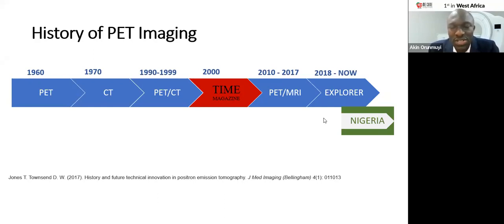And the development in PET-CT technology has continued. Now we have PET MRI, and recently there was the whole body PET scanner that does a PET scan in a matter of seconds. It's the Explorer. They're quite expensive equipment, but indeed PET is pushing the frontiers of medical imaging as we now know it. Next slide, please.